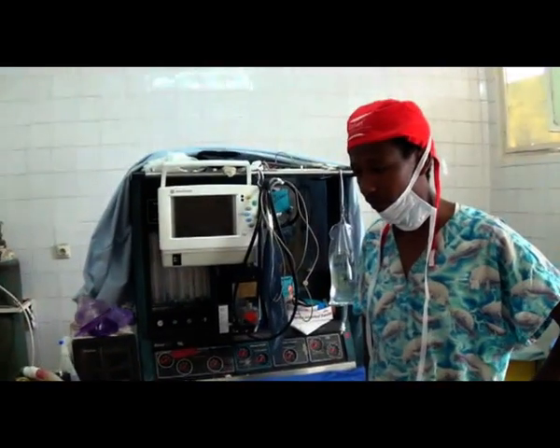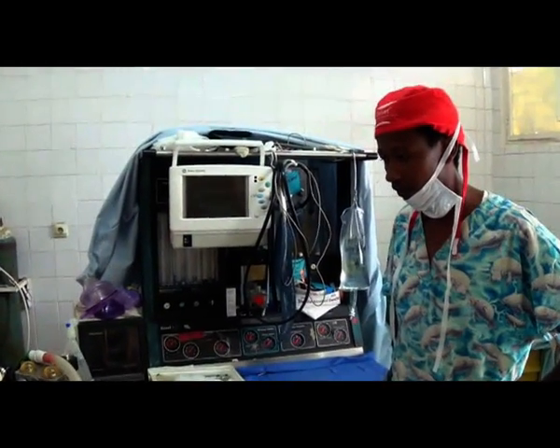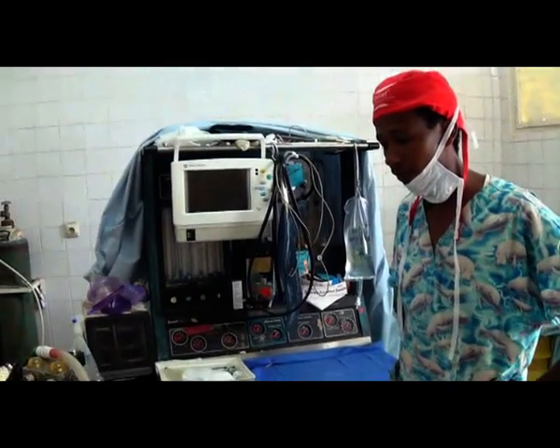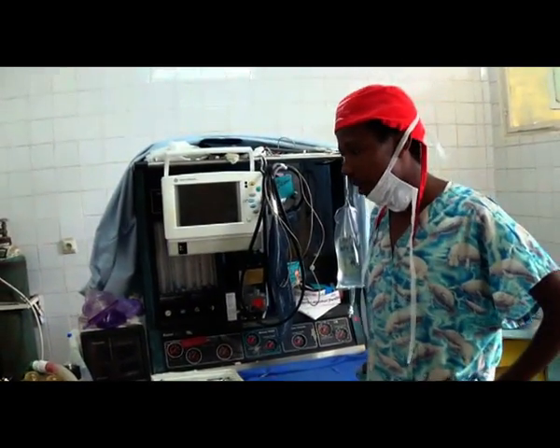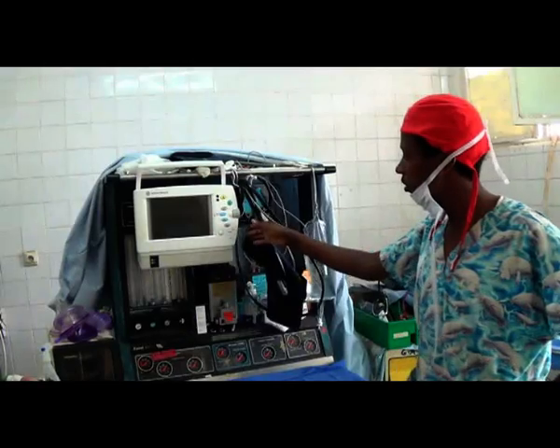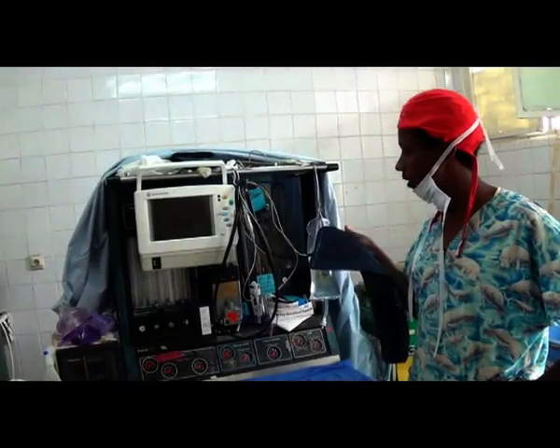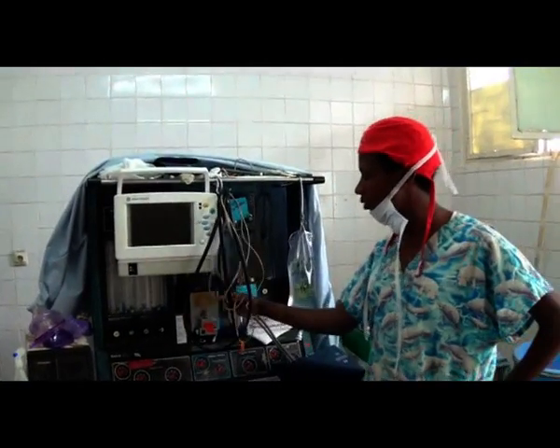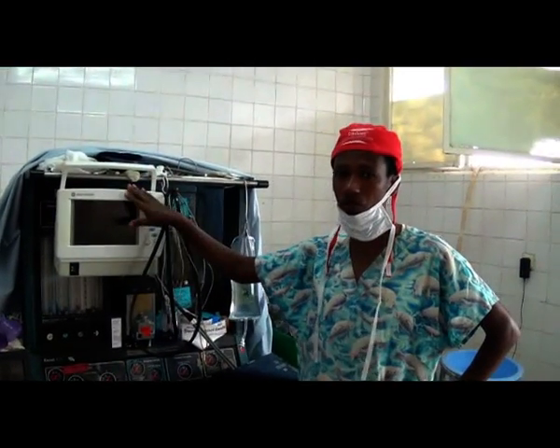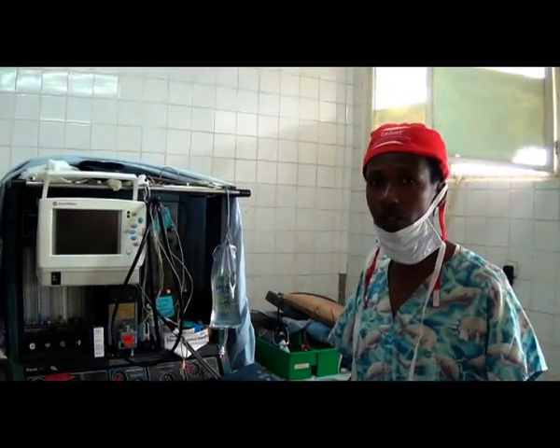So, how can you be sure that by increasing the amount you are supplying, it is sufficient for the patient's life? Actually, I don't have anything else. What I do have is depending on the patient's vital signs. As you see here, this one is the mini monitor. It will monitor only non-invasive blood pressure and the pulse oximetry. I will depend upon these two monitors, even though they are not accurate. I will depend on them and on my own vision, and I will increase the dose of anesthesia that is important for my patient.